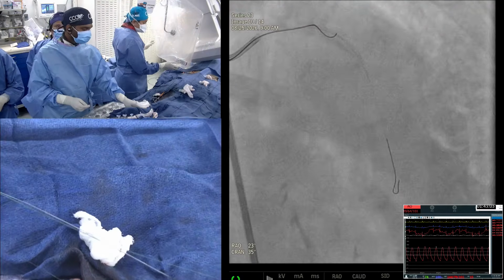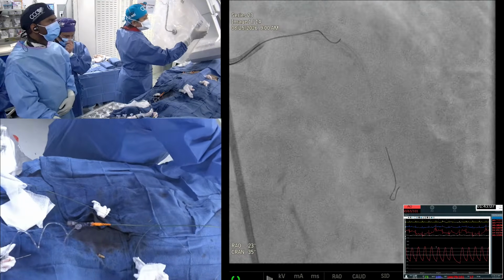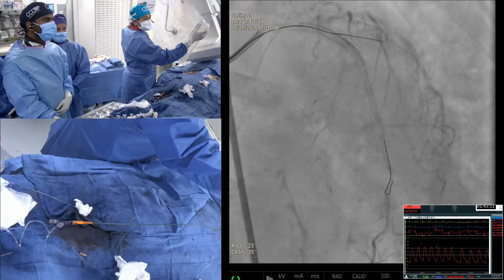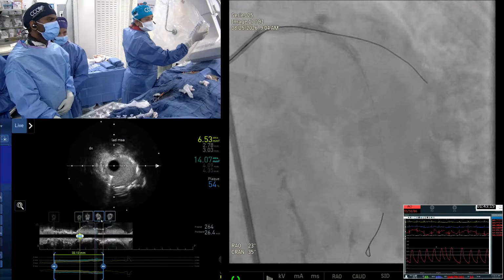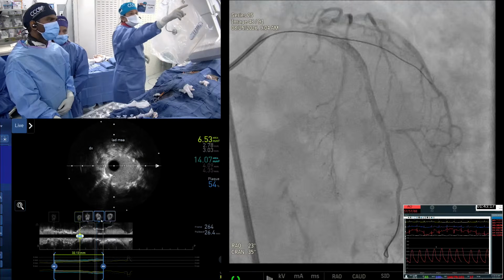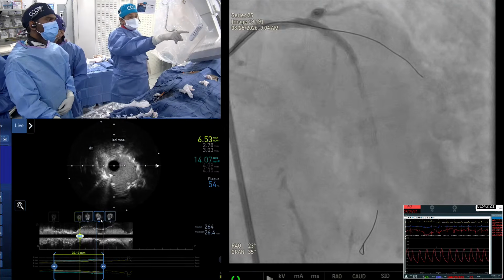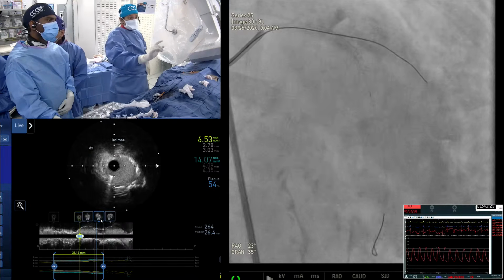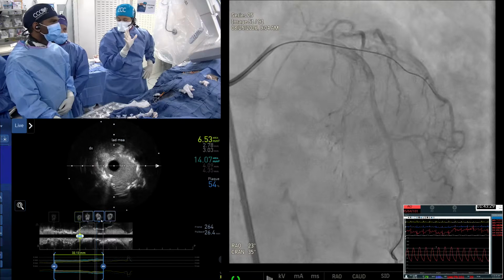So that was that. And of course, the fingers matter. We were able to get there. Here, since the wire is dark all over, you're not sure. But if you see how the diag was before, we knew we are in the diag. We didn't have any PVCs, and you can see this little dye staining at the ostium. So we know we are in the diag.